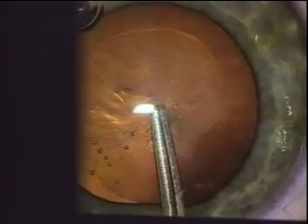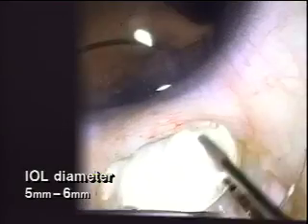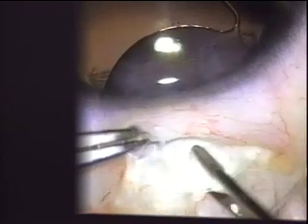Once the cataract has been removed, IOL implantation is done under the viscoelastic through a wound that is extended to the diameter of the optic chosen, which is usually between 5 and 6 millimeters in diameter. IOLs with optic diameters larger than 6 millimeters should be avoided when performing optic capture, because larger diameter optics would require too large of a posterior capsulorhexis opening.